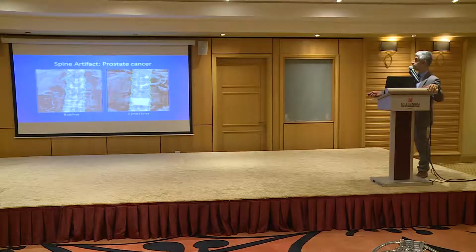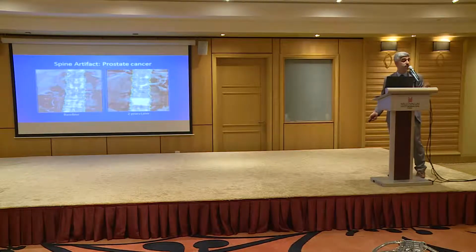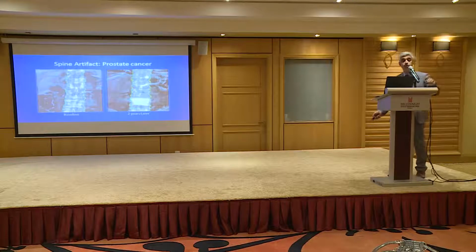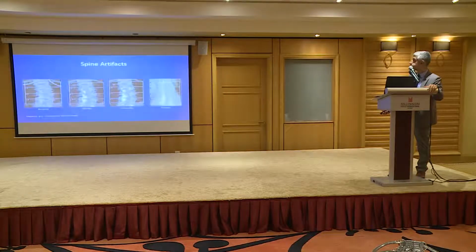This is a prostate cancer metastasis. So this is a baseline. And 2 years later, the density is actually much higher, maybe without much loss of height, but with increased density in the background of a cancer, especially breast, colon, or prostate cancer, which really love going to the bones. Then maybe this is something you want to look at, a hidden metastasis in this patient.